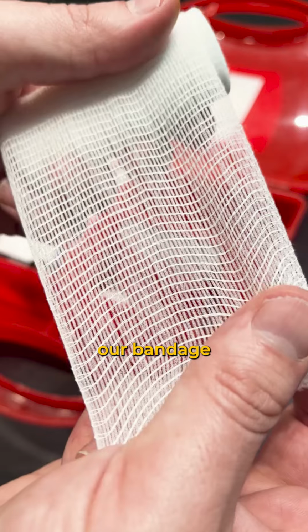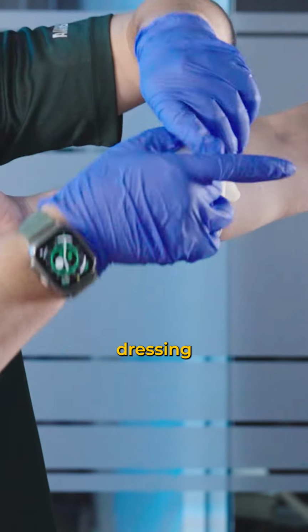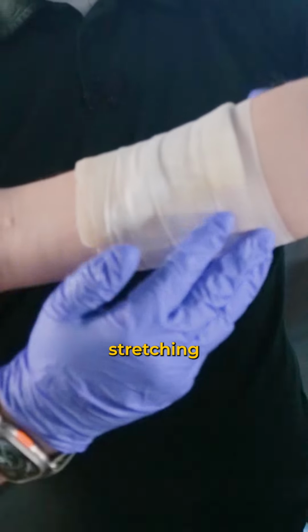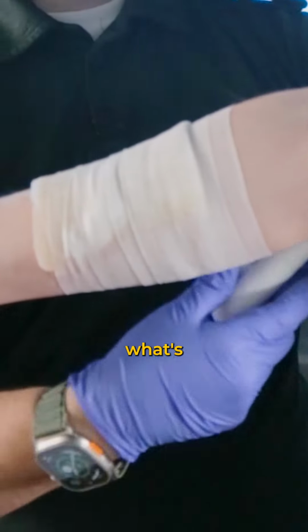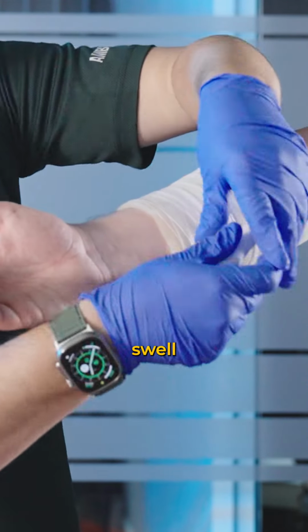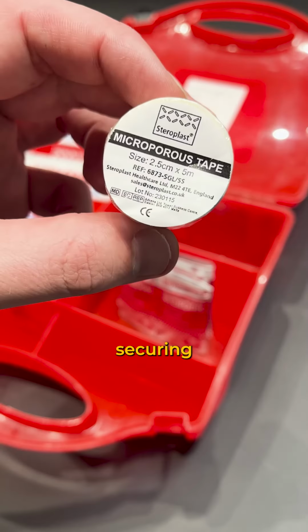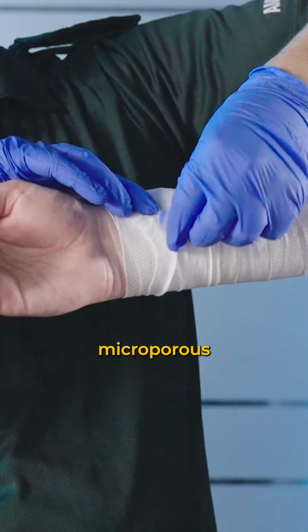So now we can open our bandage, and like we would bandage anything else, just to secure this dressing in place, slightly pulling and stretching, but not too much, because what's going to happen with a burn is it's most likely going to swell. Doing our normal 50% overlap from the elbow down to the wrist. So securing the bandage into position using some microporous tape.